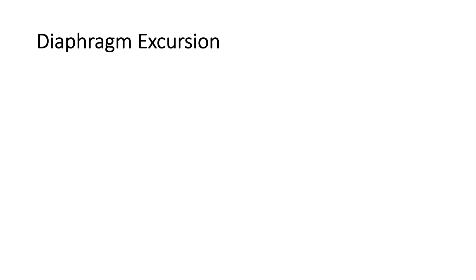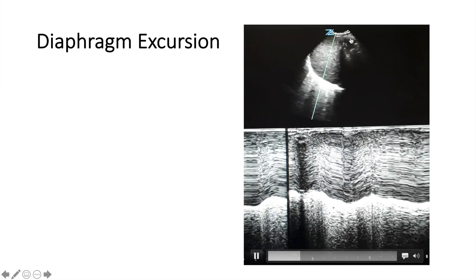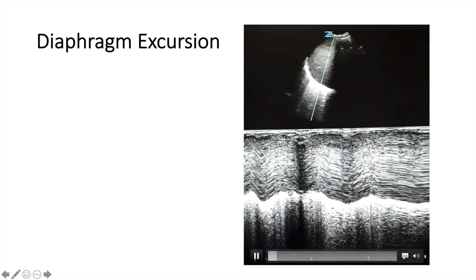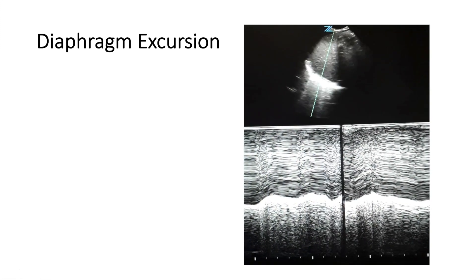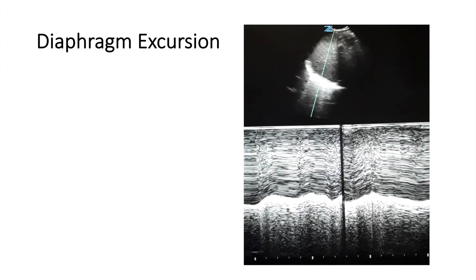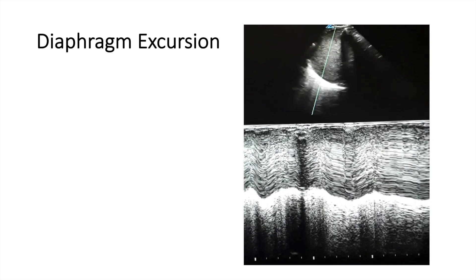The next thing we can assess by lung ultrasound is diaphragmatic excursion. You want to see how much the diaphragm is moving up and down. You apply M-mode and you can see the excursion of the diaphragm. If it's moving one centimeter or more up and down, that's normal. If it's not moving more than one centimeter between respirations, it's not moving that much and this could indicate diaphragmatic paresis.